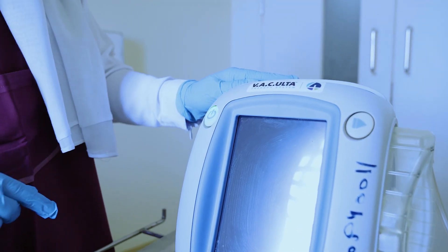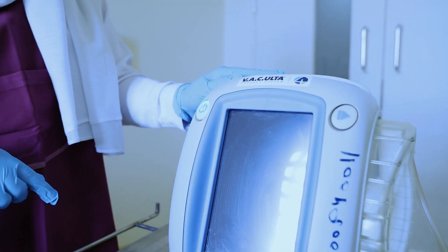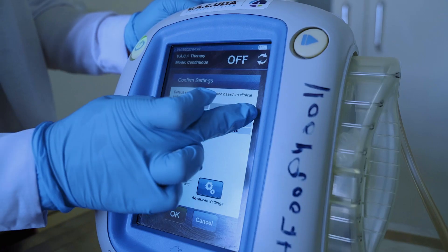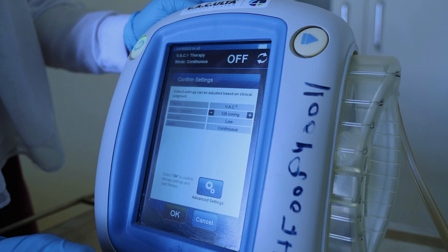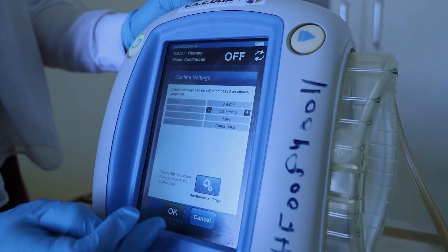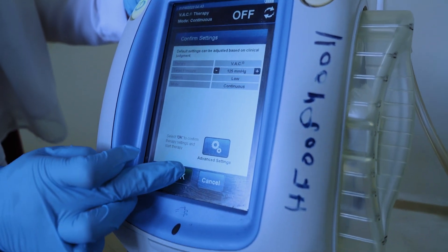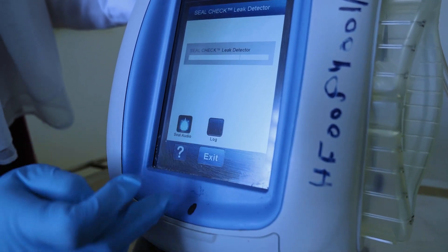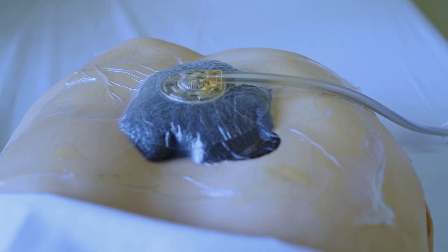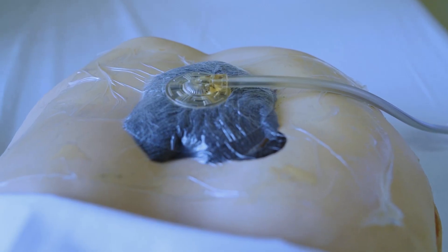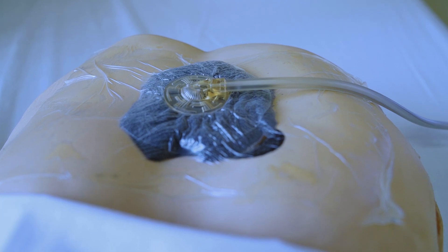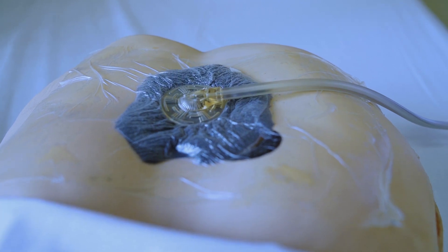Turn on the vacuum unit. Set VAC therapy to the recommended pressure according to the physician or wound care nurse order. Observe the shrinking of the foam — shrinkage confirms a good seal, allowing the accurate application of pressure and treatment.